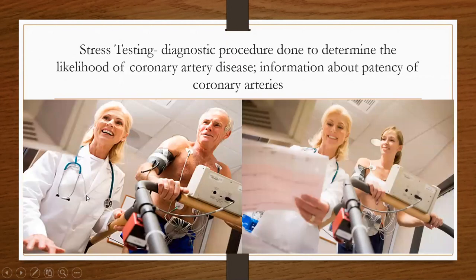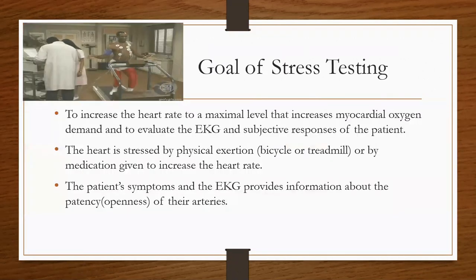Stress testing is a diagnostic procedure that's done to determine the likelihood of coronary artery disease, and it provides information about how patent or open the coronary arteries are. The goal of stress testing is to increase the heart rate to a maximal level that increases the myocardial oxygen demand so that you can evaluate the EKG and subjective responses of the patient.